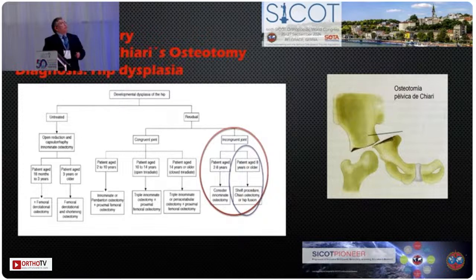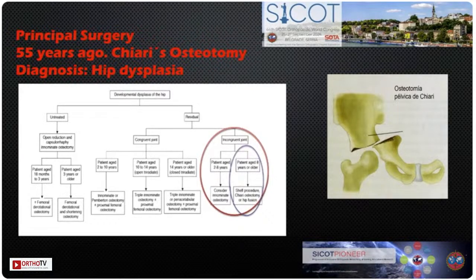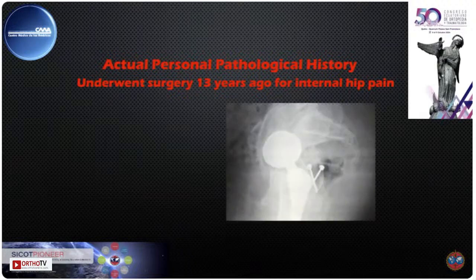In the history, 55 years ago, a Chiari osteotomy was made. The diagnosis at that moment, hip dysplasia, okay? She underwent surgery 13 years ago for internal hip pain. This is the X-ray at that moment.